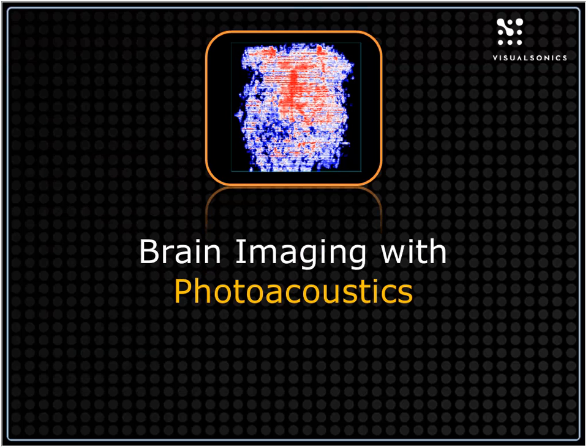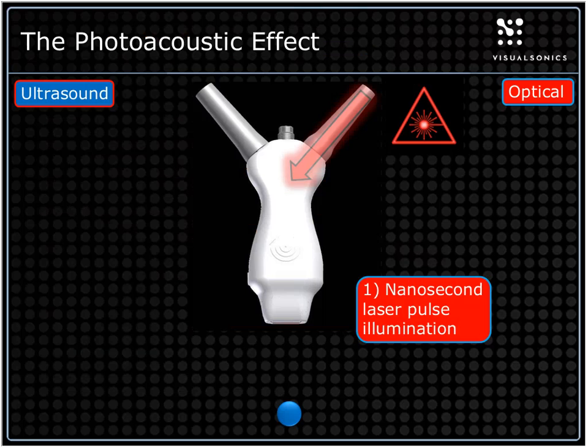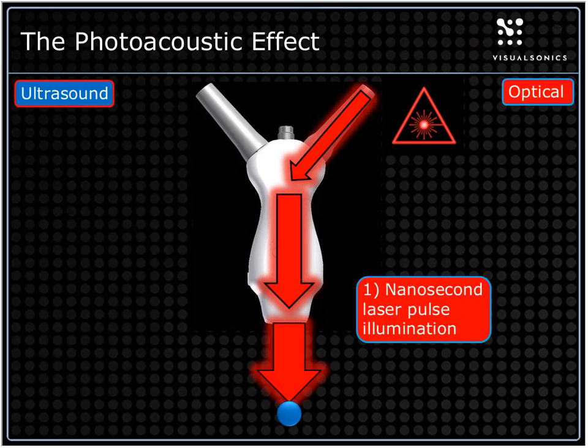I want to move away a little bit from the ultrasound aspect for the time being and just introduce photoacoustics. For those of you who are not familiar with photoacoustics, I'll just describe the effect. Photoacoustic imaging is essentially the combination of optical and ultrasound imaging. It's a hybrid modality. So we deliver a nanosecond laser pulse illumination into the tissue.